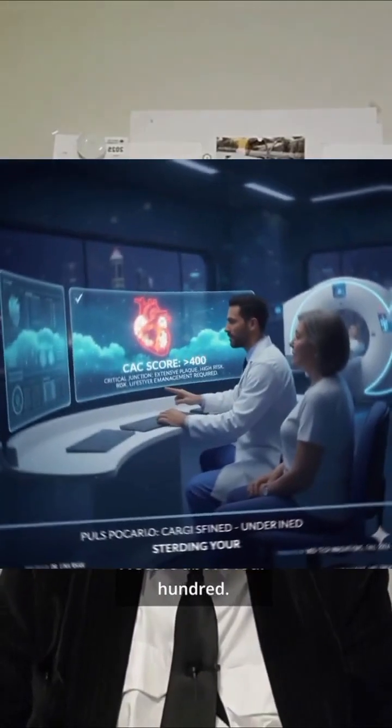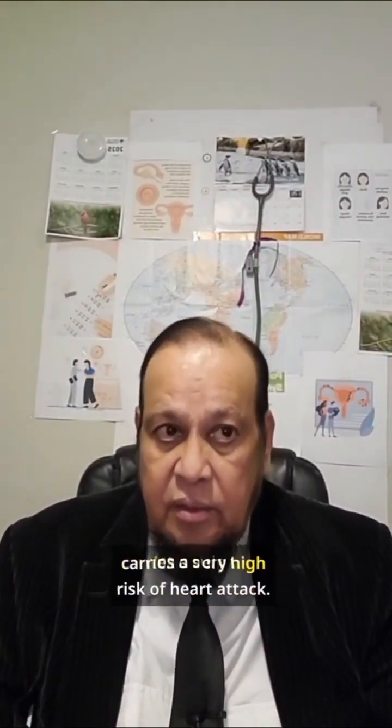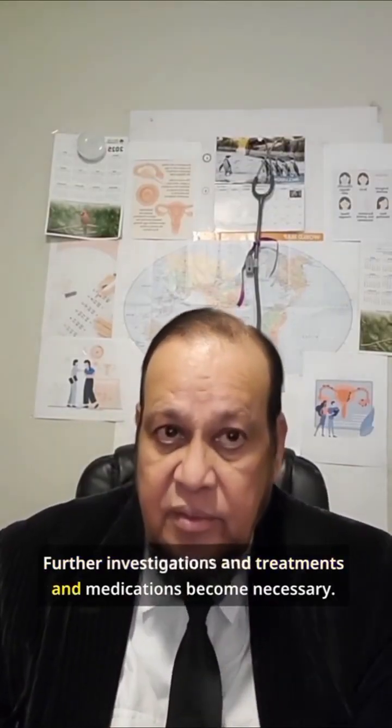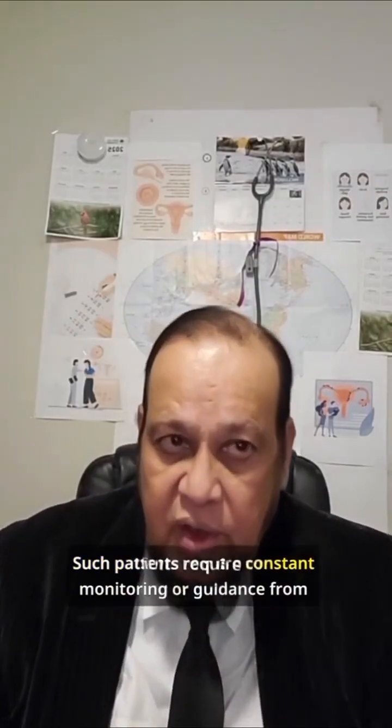A score above 400 indicates large-sized plaque. This is a sign of severe disease and carries a very high risk of heart attack. For this, further testing, as well as additional treatments and medications, become necessary. Such patients always require the supervision or guidance of a cardiologist.